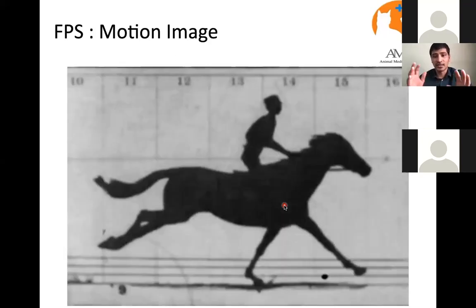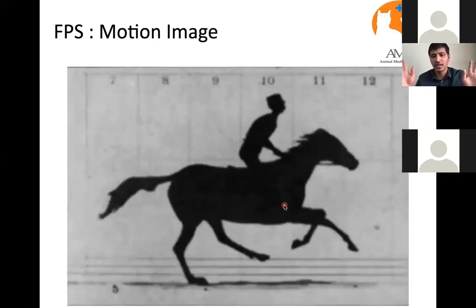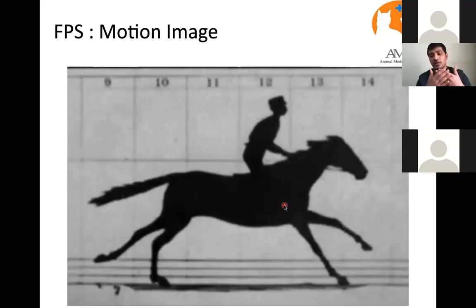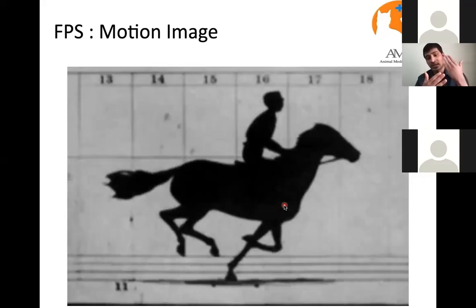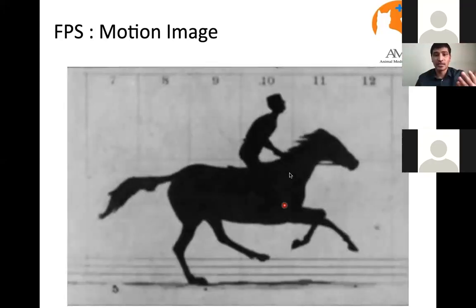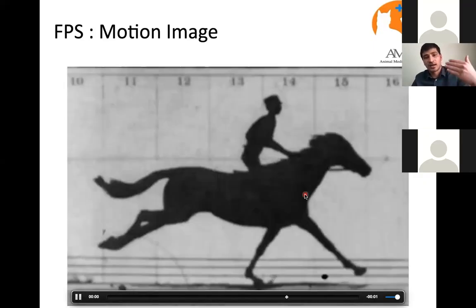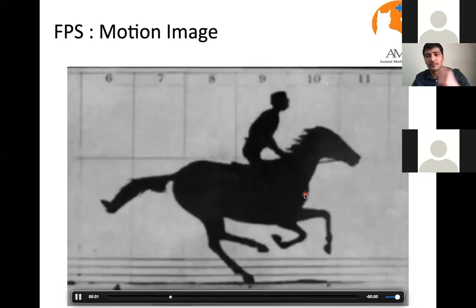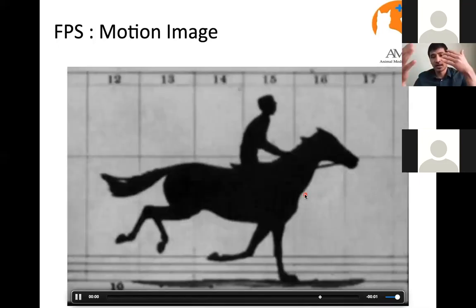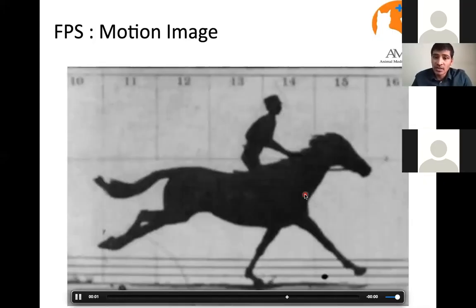Here we can see how we see the moving image in the ultrasound. It's not a video image. It's a combination of different plots that the ultrasound scan puts together, and then we see the image. This is just the picture, and this is the motion image of maybe 10-15 pictures. Like this, the machine combines the different images and gives us the real-time imaging. So this is how it works.